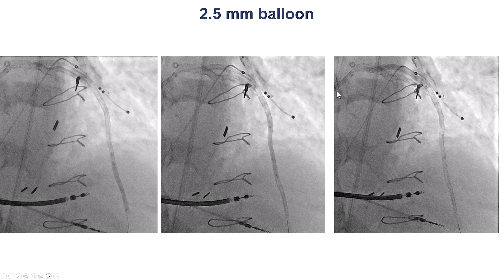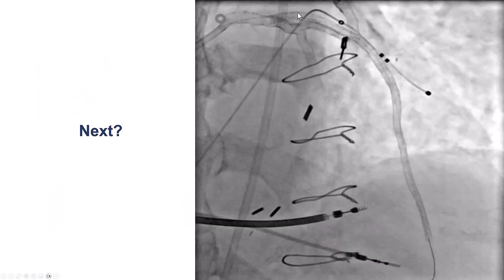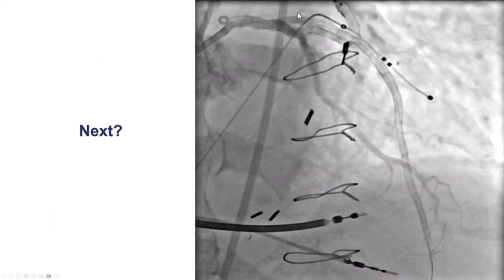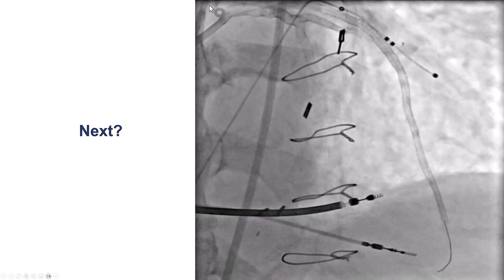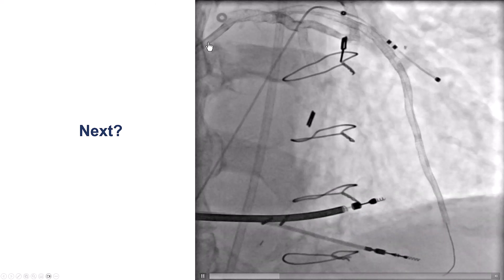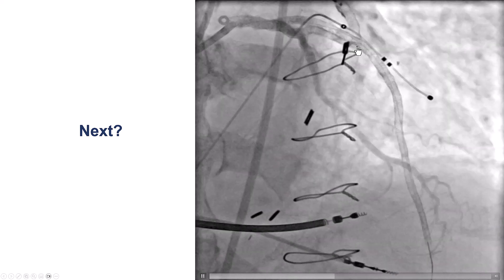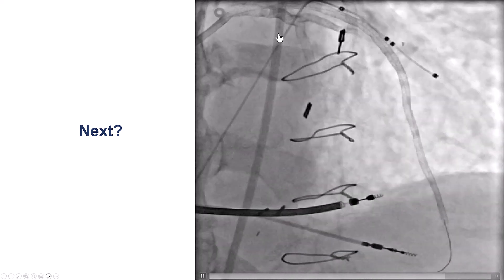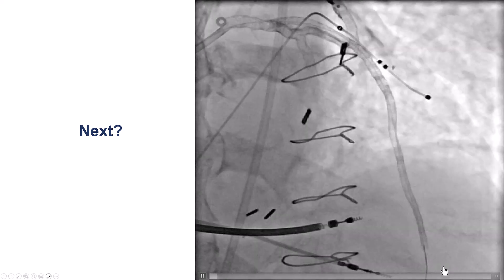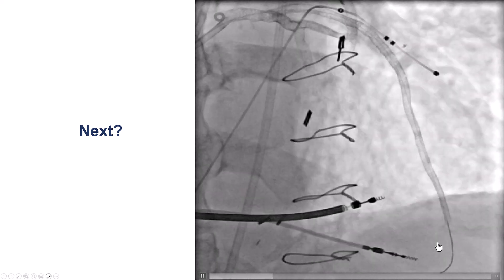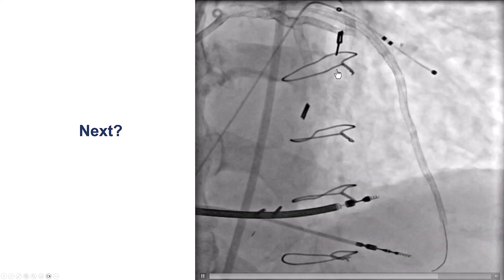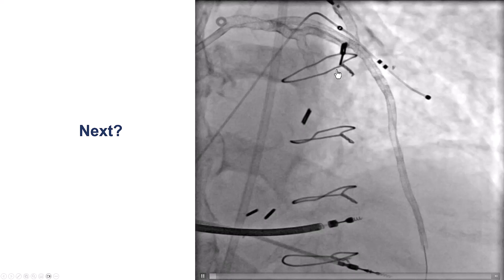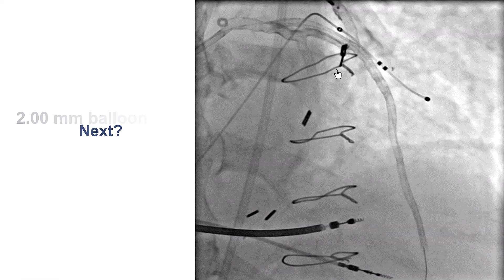We exchanged for a workhorse wire and predilated with a 2.5 mm balloon. However, unfortunately, there is not really much flow restored during this time. This can always be challenging because the question is: are we in the true lumen distally? Do we still have untreated lesions more proximally? This is not completely clear.